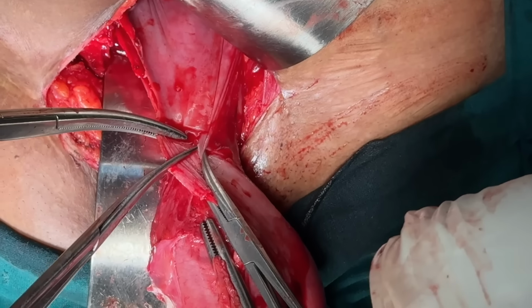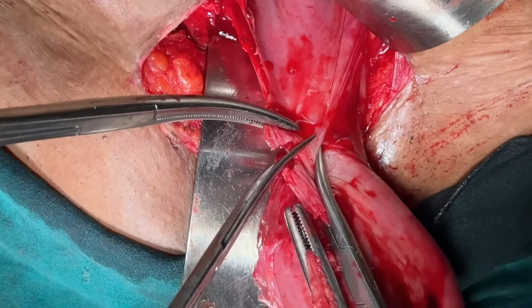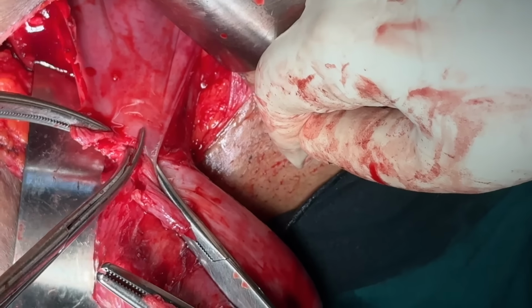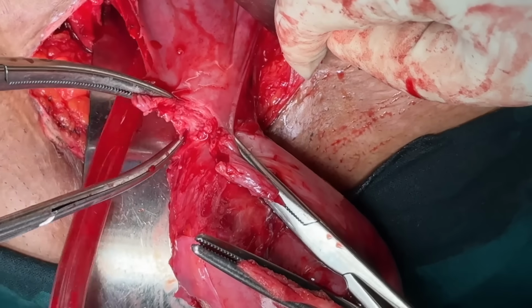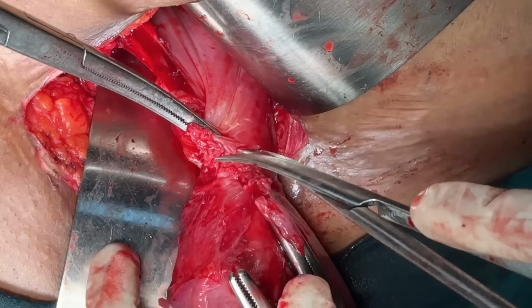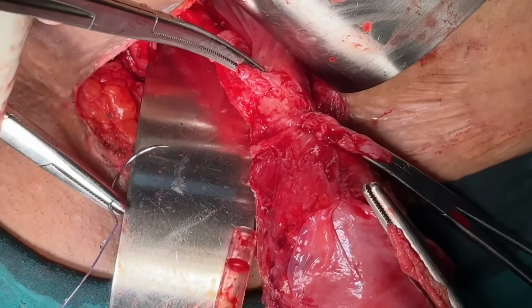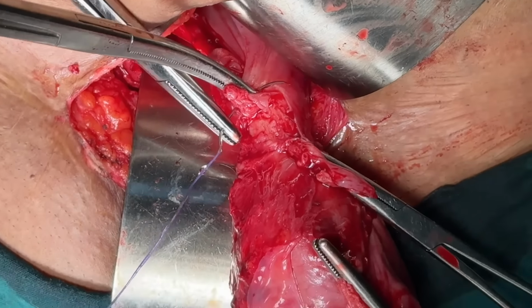As I told you, only for cornual structures I usually teach that you can use cautery. Lower down, either you can use the scissors or the knife. Cut it in a good L-shaped fashion to have a nice pedicle to tie. And then transfix it as mentioned earlier.